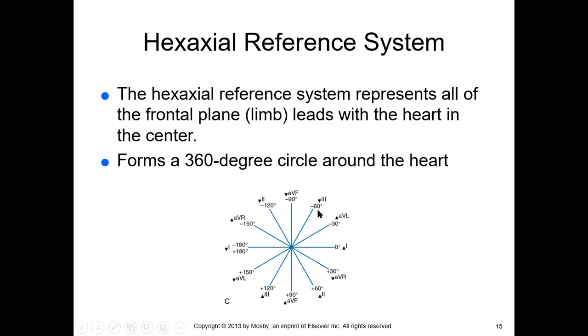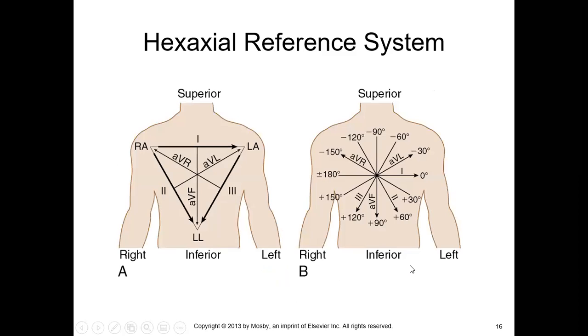So if you add 30, 60, 90, and so forth. But remember now, you have negative on one side because it's a positive, and it's the negative. So down here is the positive pole. Up here is the negative pole. So all degrees in the upper are negative and all in the bottom are positive. That's the picture.